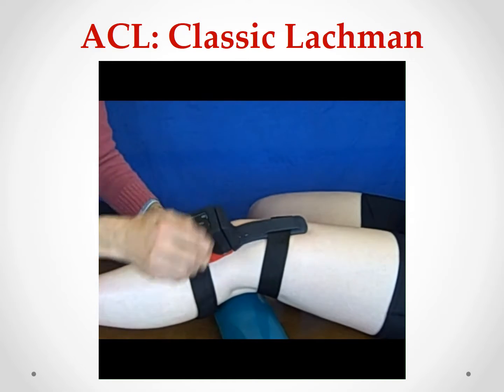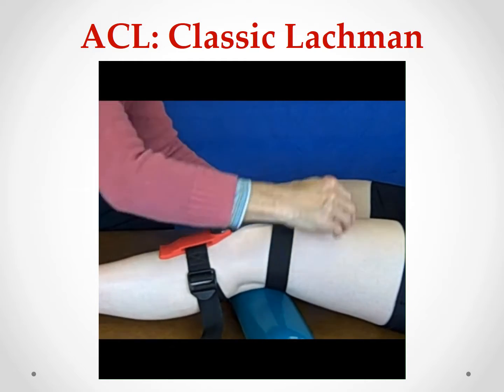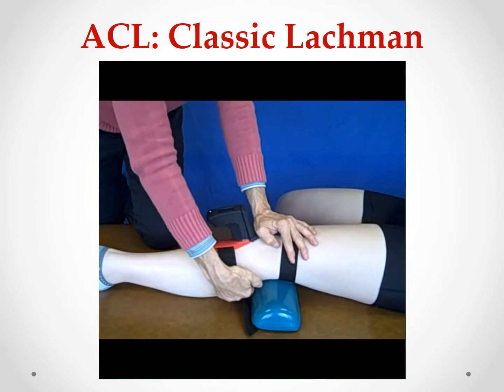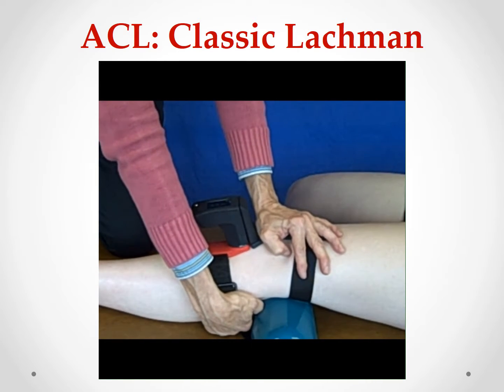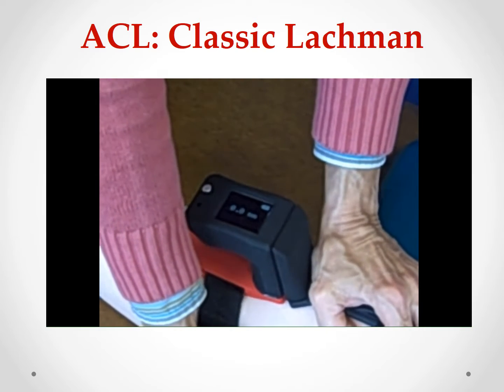The device is placed on the knee in a position of 15 to 20 degrees of flexion, the optimal position identified for the Lachman's test to minimize some of the problems that we just discussed. And then the device is stabilized with the device aligned with the joint line of the knee. And you see that being confirmed right there. The proximal segment is stabilized and the distal segment is translated. Again, you see an intact knee with an abrupt end feel, but you see the device translating and a quantitative value is displayed on the LED, as you see here.